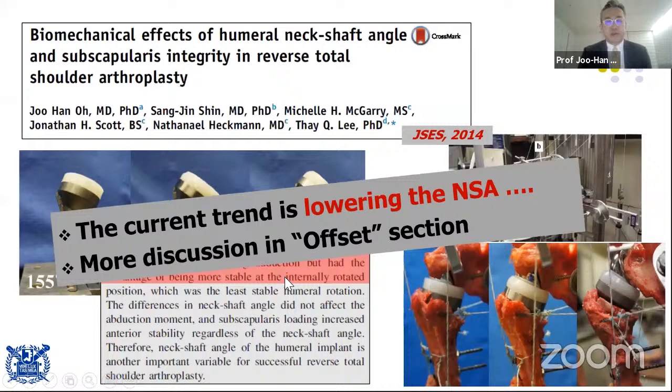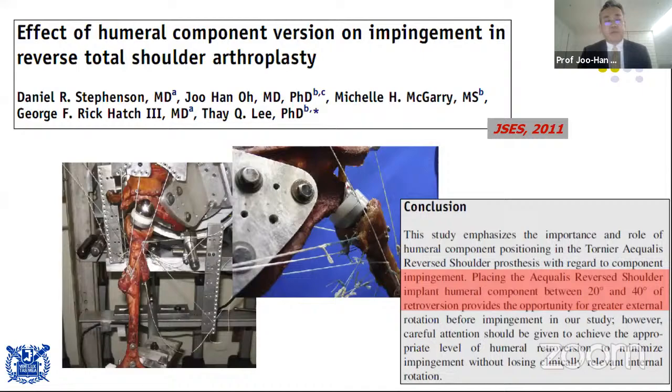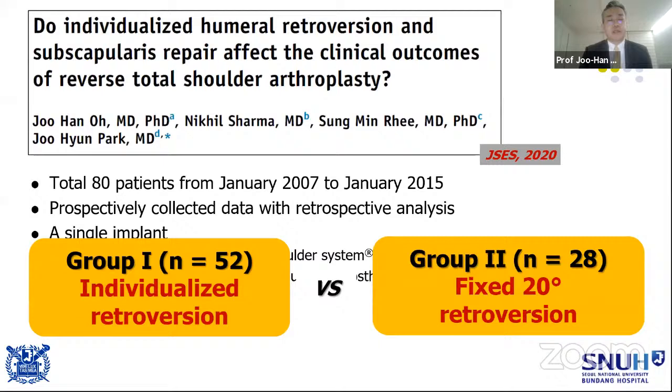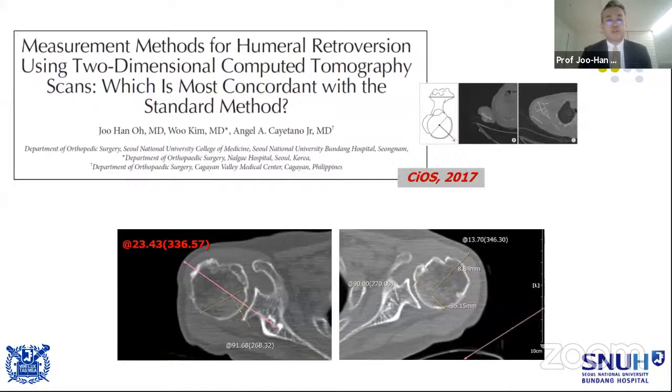And also the traditional concept of the humeral retroversion in reverse is usually zero or 20 or 30 degrees of retroversion, according to experts' opinion. But several biomechanical and clinical studies, including one just published last year, show that individualized retroversion, according to the patient, gives superior clinical outcomes than a fixed 20 degrees of retroversion. So I usually do a CT scan including the elbow, and I measure the patient's specific retroversion setting.